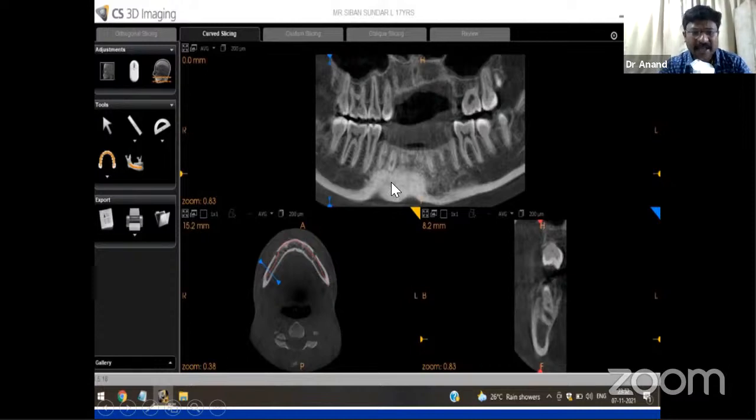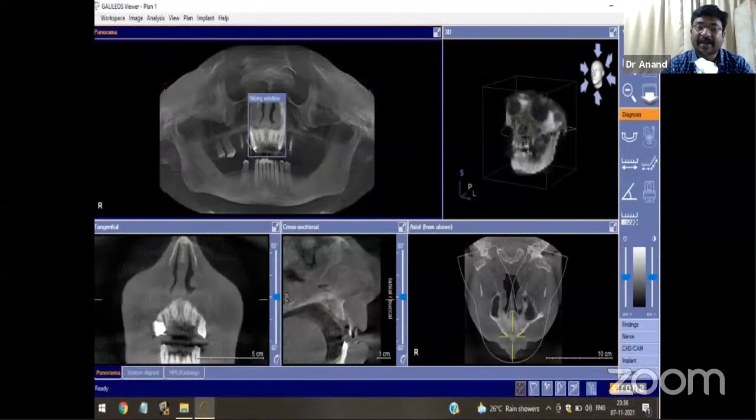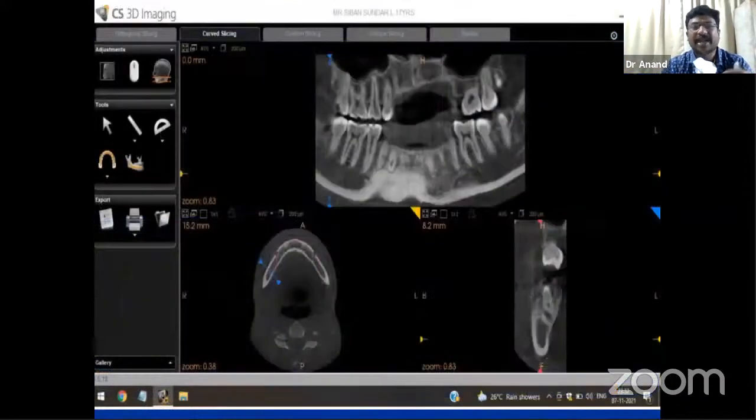So if I need to see the lower teeth also, I have to raise the area and draw the curve properly in that area so that we can see the mandible properly. In the previous software, you had a predefined curve, and hence, since it is a large focal trough, both the maxilla and mandible were seen in relation to a specific structure. Whereas here you have to adjust the focal trough so that you can see the maxilla separately and the mandible separately.